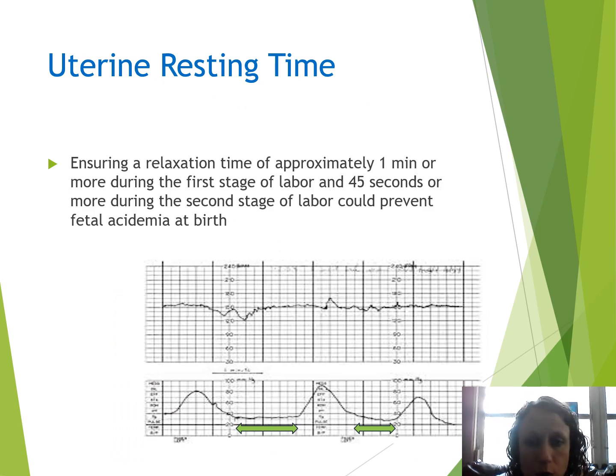We want optimal resting time. So usually they say about 1 minute during the first stage of labor and 45 seconds during the second stage of labor. And the reason is because the contractions are cutting off blood flow. So if we have that good resting tone in between, baby's able to catch a breath. If you're sitting there holding your breath, you want to have enough time to go, oh, okay, I can breathe again. Okay, now I'm ready. And then hold the breath again. So you want to give baby enough time to catch their breath, get a little rest.